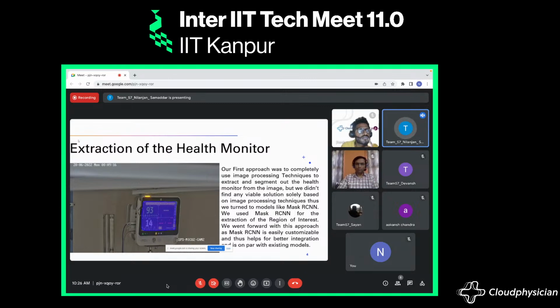So we moved on to deep learning models like YOLO and Mask RCNN. We chose Mask RCNN as it had better pixel accuracy. It was better at handling complex cases where the monitor was not aligned or the lighting was not proper in the image. Also, Mask RCNN is much more flexible than YOLO in implementation.